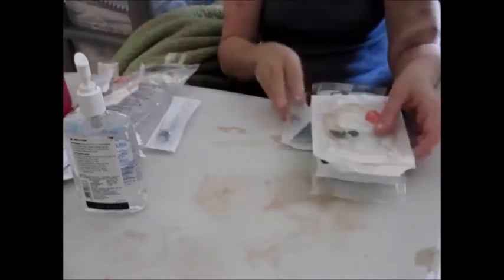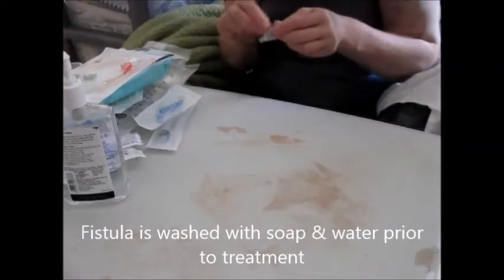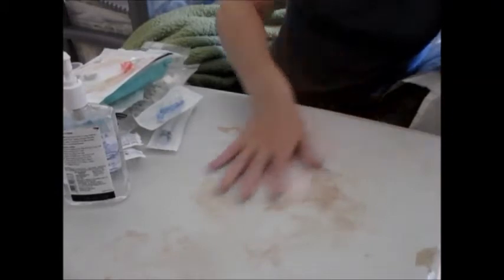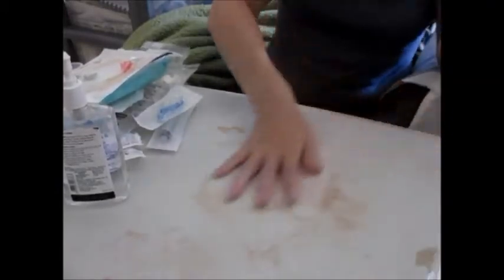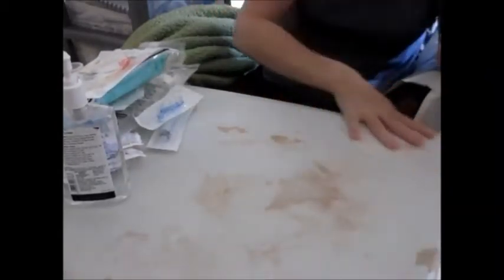So I'm just going to wipe the table first. My hands are already clinically clean — I've already washed them with soap and water and I'm just cleaning them again with hand gel because I've touched the outside of the packs. I'm wiping the table down with the sani cloth. This table is quite stained from various spillages over the years, but my pack is sterile and hopefully won't have any tears in the base.